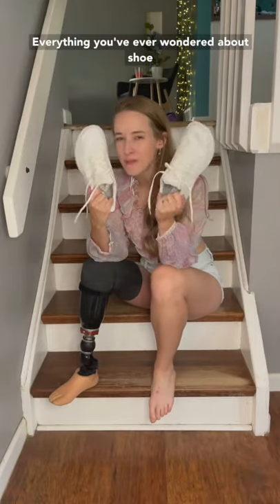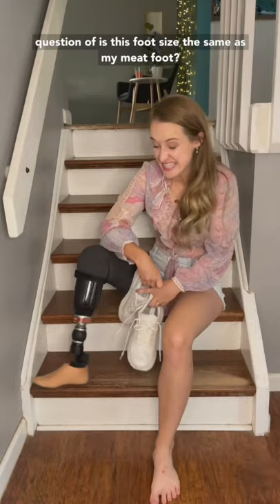Everything you've ever wondered about shoe sizes and prosthetic feet. I'll often get the question: is this foot size the same as my meat foot? If not, do I have to buy two pairs of shoes? Do I have to buy the sizes separately?